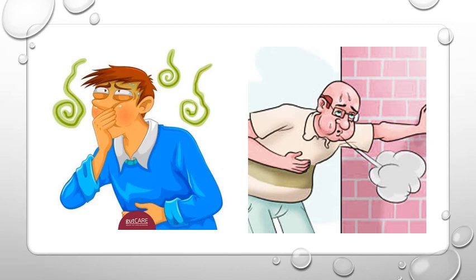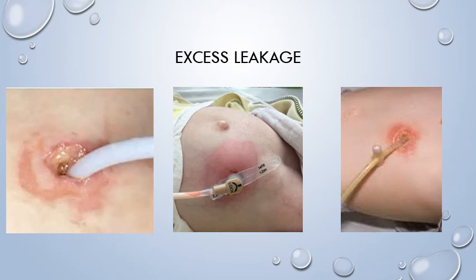For excess leakage around the tube, the delegating nurse will instruct you about what is normal leakage compared to excess leakage for a person. The nurse will provide specific steps for care of the leakage. Excess leakage from a tube insertion site or the stoma in the abdominal wall can often be corrected by adjusting the external bolster properly. If leakage persists, contact the delegating nurse.